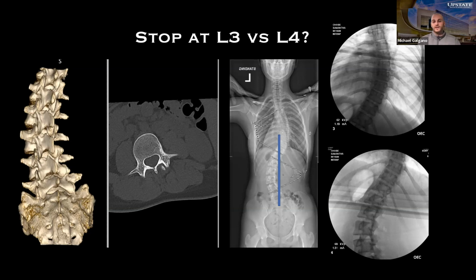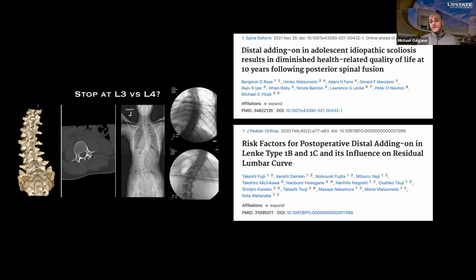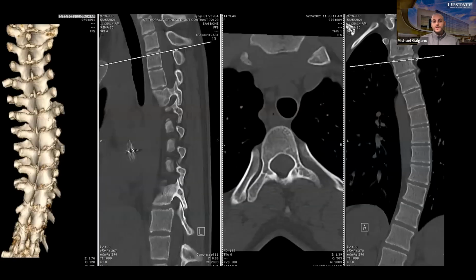And I think Mike's got a lot of good evidence from his early years of practice that patients you stop at L4, they definitely have significantly higher rates of adjacent segment degeneration down the road, right? So that's one of the reasons why maybe we would consider stopping at L3, not get a perfect result as opposed to L4. If you stop at L3 though, then there's always that risk of adding on, right? Especially if they have significant wedging between those lower two levels, or if there's significant rotation, like what this young lady had as well. So a couple of key things when you are inserting pedicles.